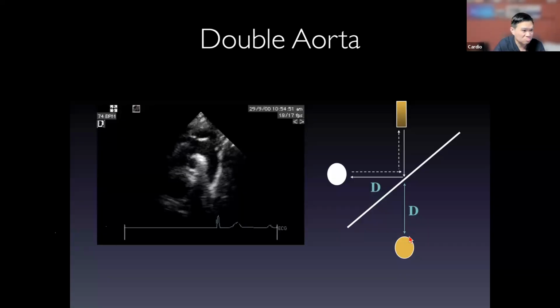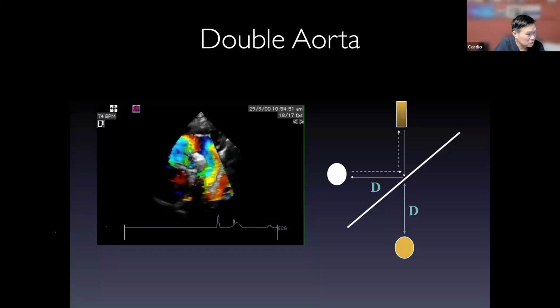So for the next day or 2 or 3 or 4, go and check it out, and you'll find it fascinating. By the way, these images were obtained when I first arrived at Sigma 2000, and it still looks pretty good after all these years. Again, this is the double aorta artifact. This is one of the first generation GE Vivids.